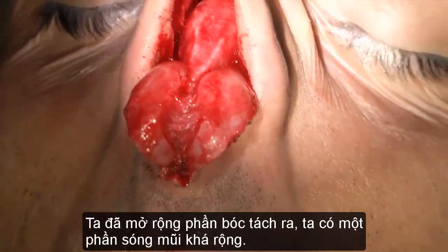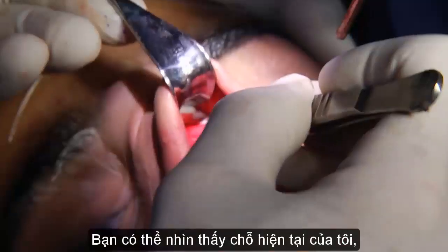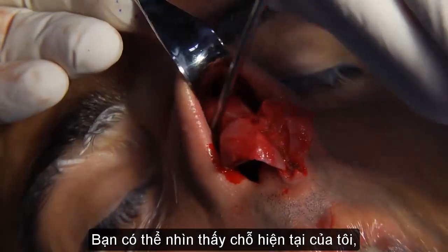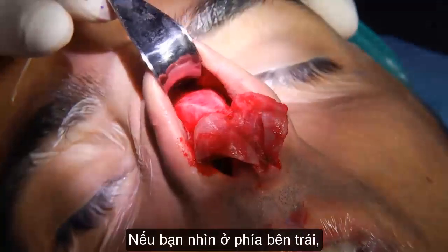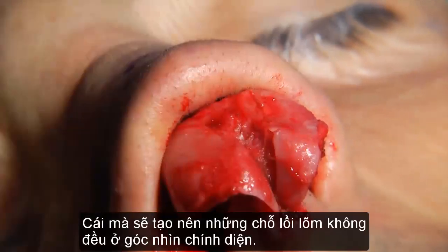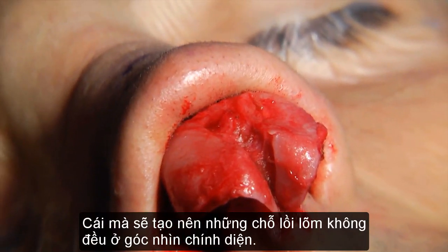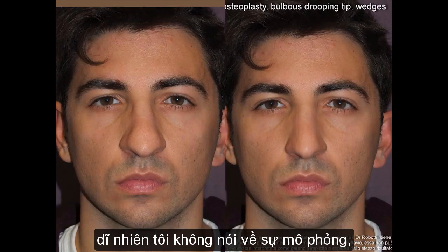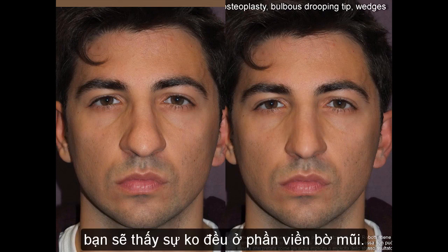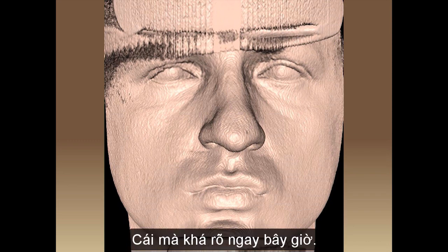So we have an extended degloving. We have a rather wide dorsum. You can actually see where he has this thing here and this thing here, which are causing some irregularities on the front view. So if you look on the left, of course, I'm not talking of the simulation, you see the contour irregular. You can actually see that contour problem, especially on the left, which is visible now.